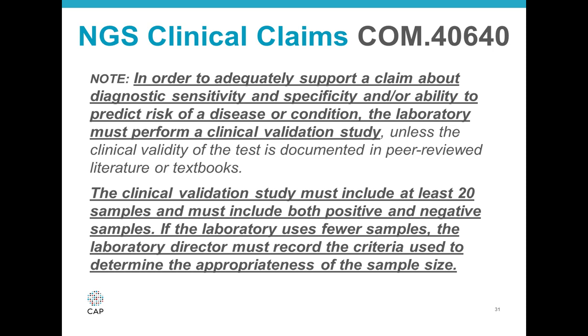This checklist item also states that the clinical laboratory must perform a clinical validation study to support any of the clinical claims that they make. And this validation requires a minimum of 20 samples.